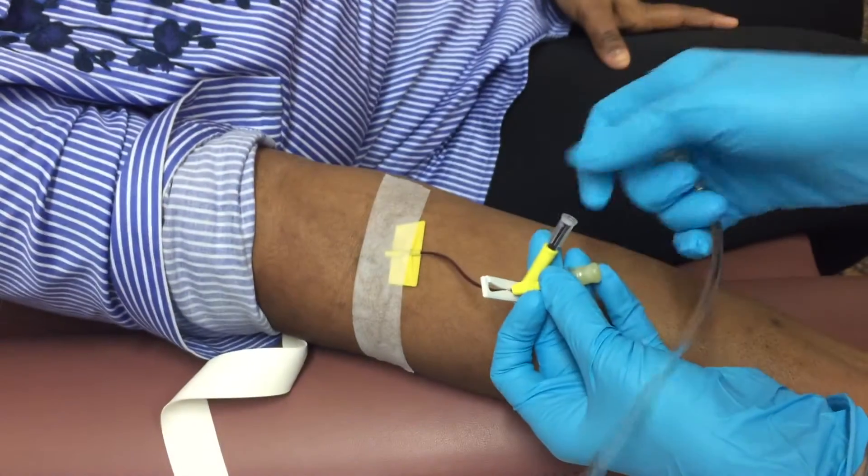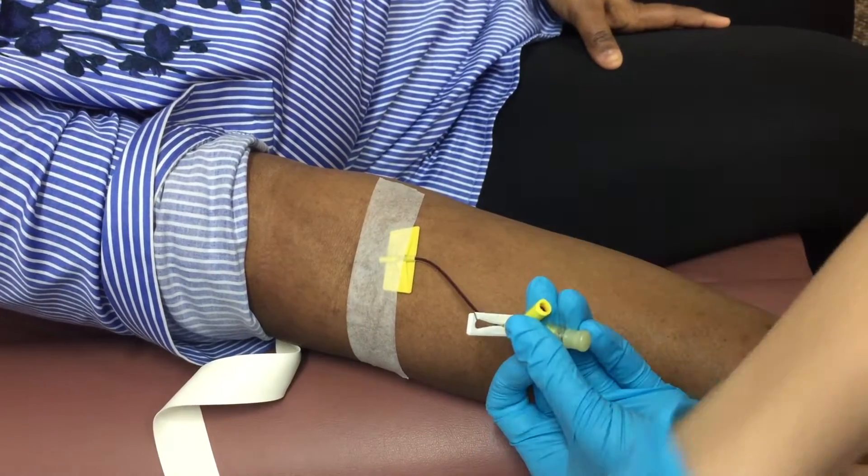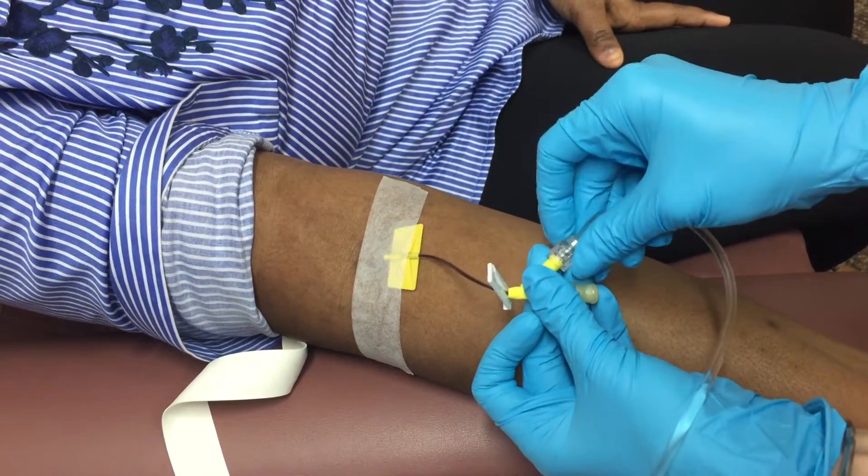After that, you're ready to test your IV line's flow ability. Connect to your drip and let it flow!